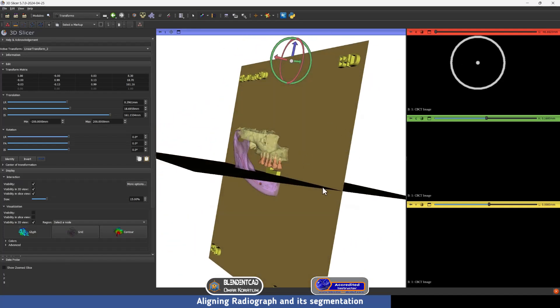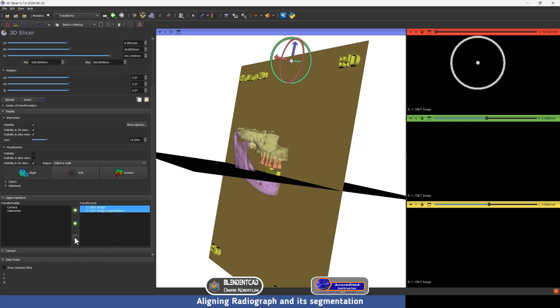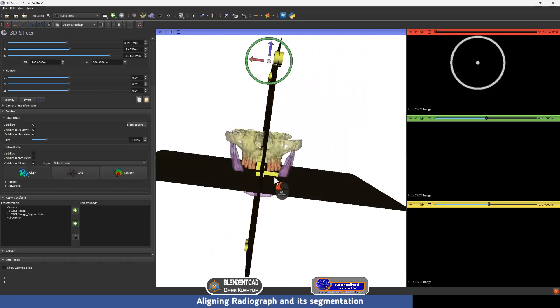After we have moved the radiograph and its segmentation to the required position, we have to select both of them in the transform table. I'm going to press on the data and then Shift-click on its segmentation. Then we are going to harden the transformation using this icon. As you can see, its position has been fixed to the position we set.